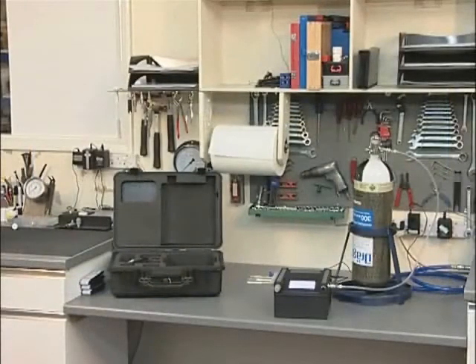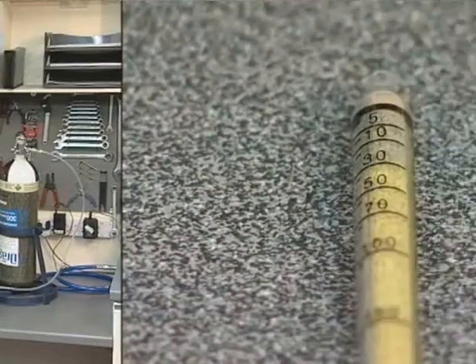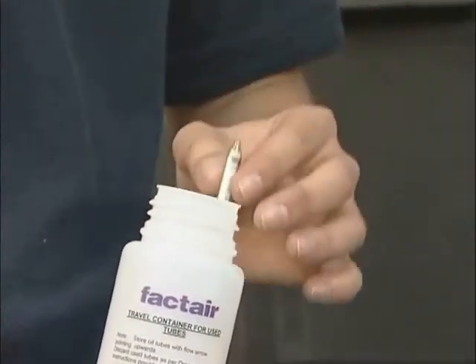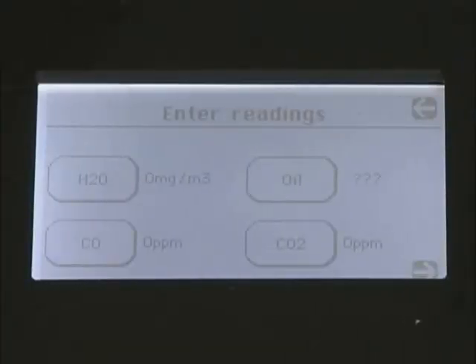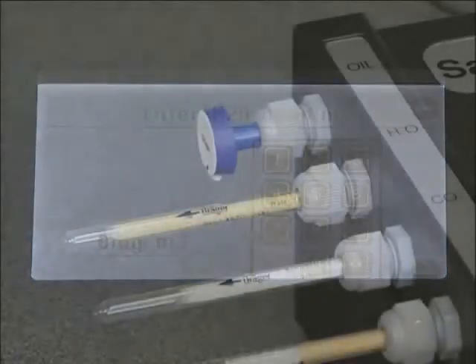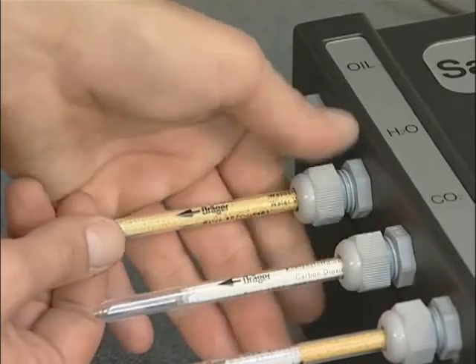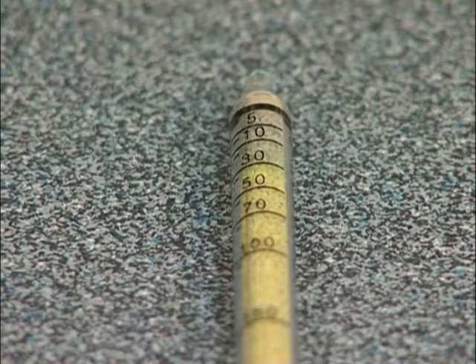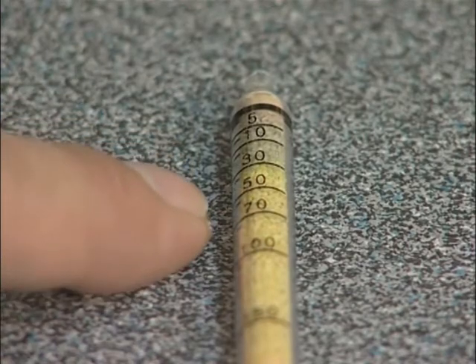Once the test is complete, the readings from the three tubes and impactor can be entered. Instructions on reading detector tubes and their safe disposal can be found in the documentation wallet. To enter the water reading for the F4001 version, press the H2O button and remove the corresponding tube from the test port. The water tube shows the amount of moisture present in the sample as a brownish stain on the yellow crystals, measured against the scale in milligrams per cubic meter.